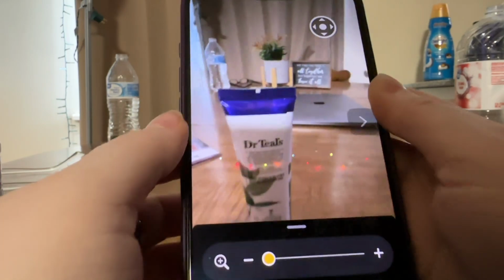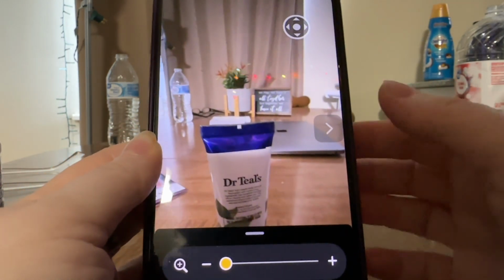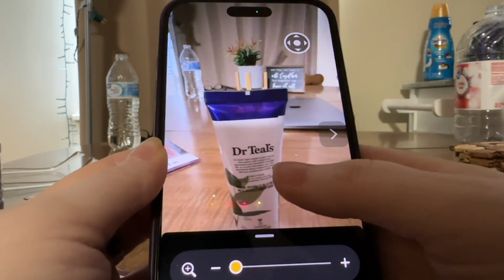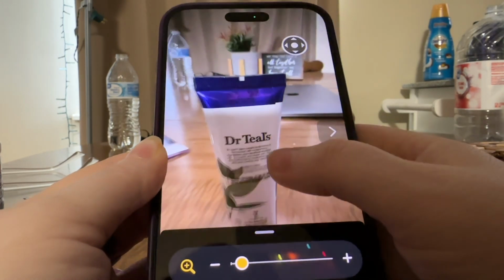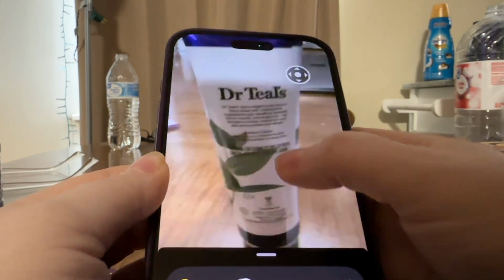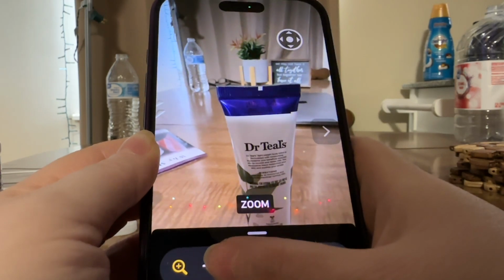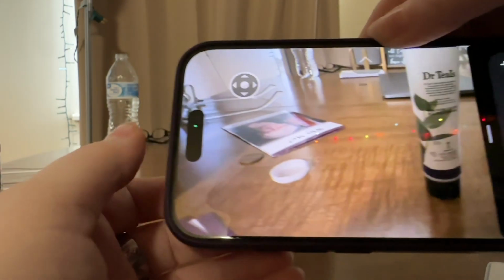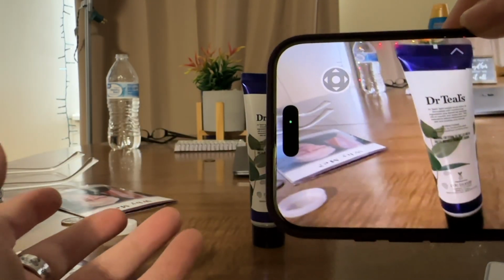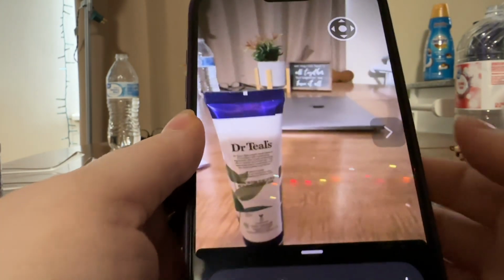I also wanted to go ahead and just talk a little bit about the magnifier app on the iPhone, because it's a native app to the iPhone. So it's also free, and you can do some very similar things. You can zoom in by moving your finger up and down. You can use this little slider bar. You can also go sideways, but that's just more of holding your phone. The controls don't slide over, so I don't know if that's extremely helpful or not.